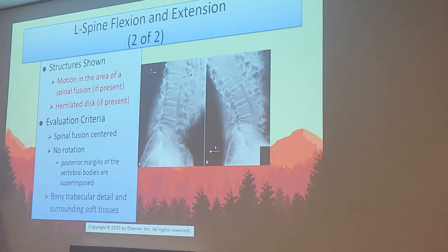Jay? I was going to ask if we have a patient who's pregnant in the OR and we're still doing x-rays and all that, the best option would be to select low dose. Do we also do pulse? You always do pulse, period, unless the doctor indicates otherwise. I don't care if they're pregnant, young, old, whatever. You always do pulse radiography. That's a dose safety measure.